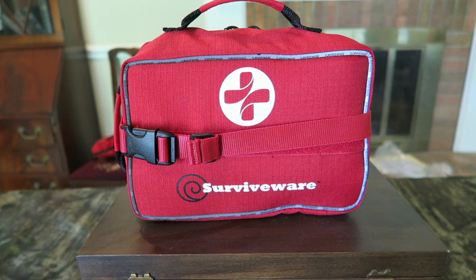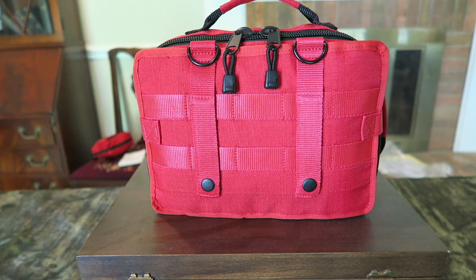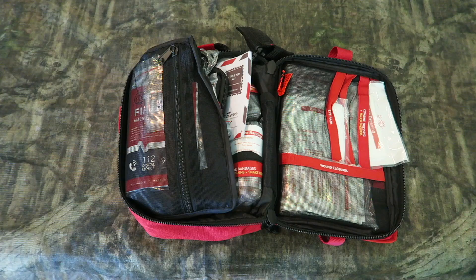On the SurviveWare large first aid pack, let's take a closer look at the bag. There it is, all laid out. Now keep in mind, there's probably about three pounds of first aid gear in there. I am impressed with what I'm seeing so far, and this one will probably travel with me in my vehicles, especially the adventure van.